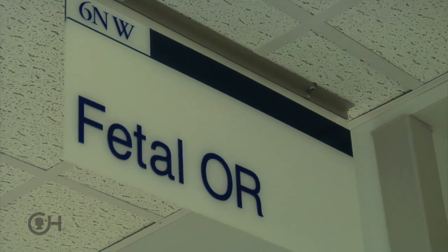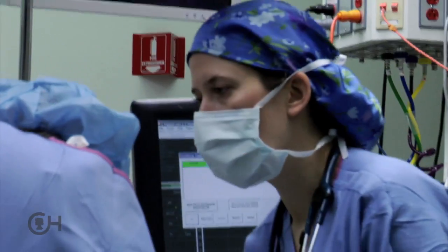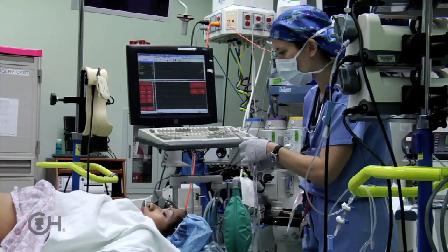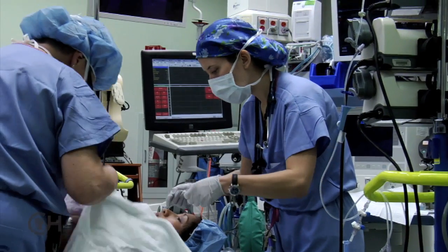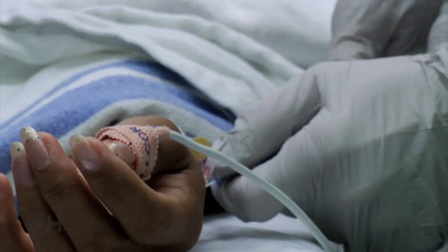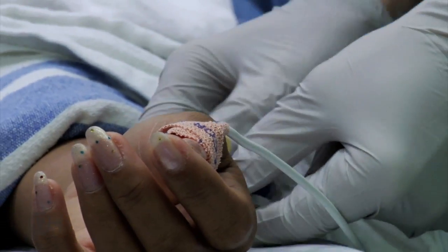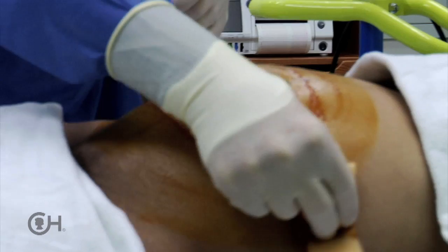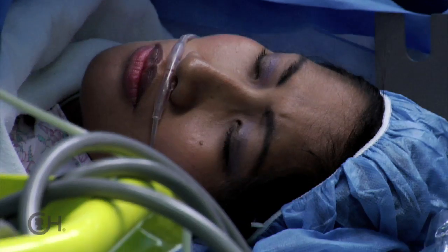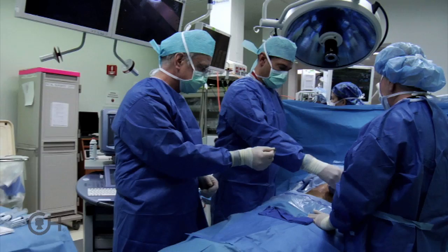To place a shunt, we do that in the operating room. In utero shunting is performed as an outpatient procedure in the SDU, which is our special delivery unit. Moms will arrive and will be prepped for the procedure and will receive anesthesia services. The patient gets sedation through their IV and is comfortable. We use local anesthesia so they're numb and don't feel the procedure. The sedation that the mother gets is transmitted across the placenta, so the baby does get some of that sedation as well.